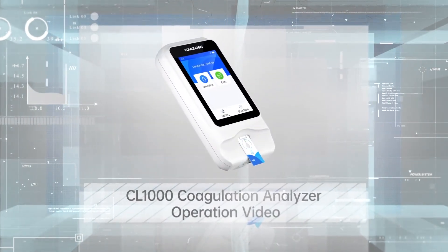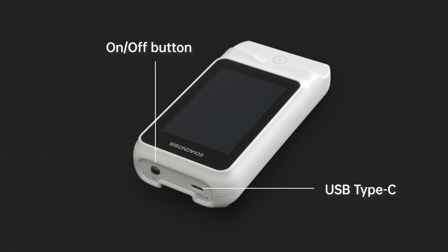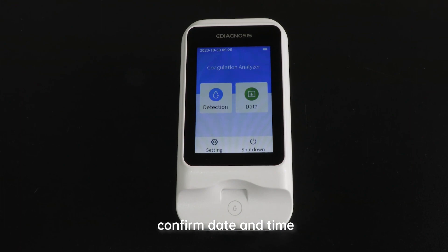CL1000 Coagulation Analyzer Operation Video. Step 1: Startup. Connect via USB Type-C. Press the On/Off button for 2 seconds to turn on the analyzer. Place the analyzer on a flat surface or hold it steadily in the hand, then confirm the date and time.